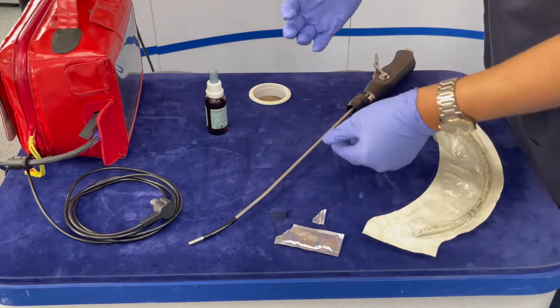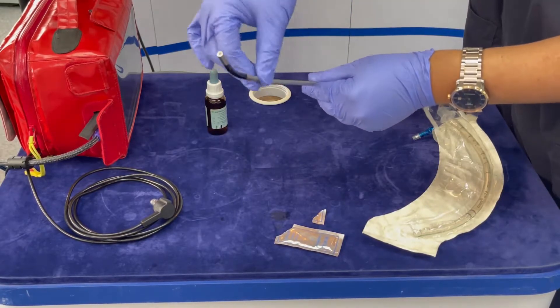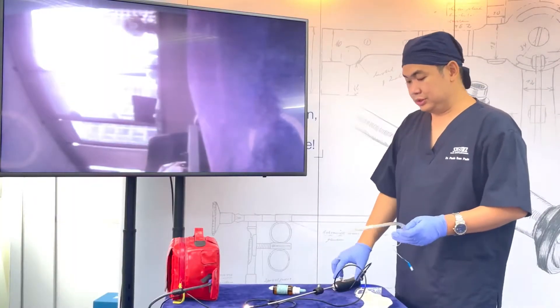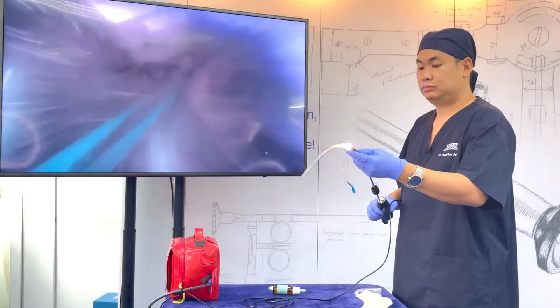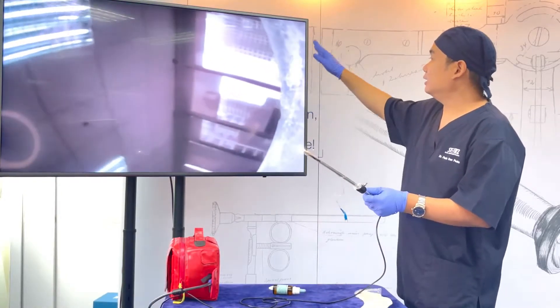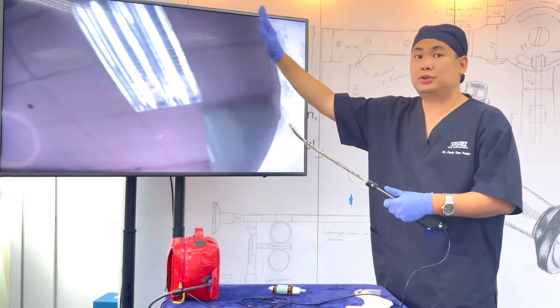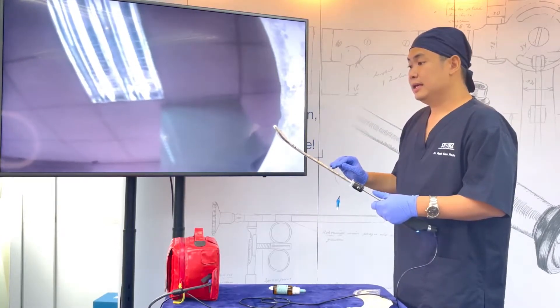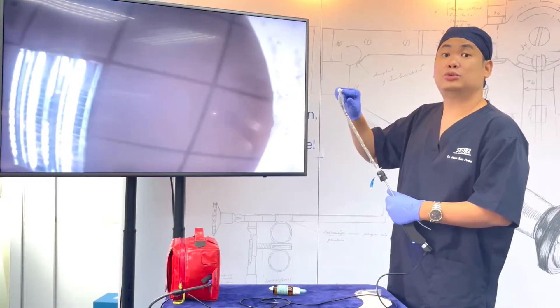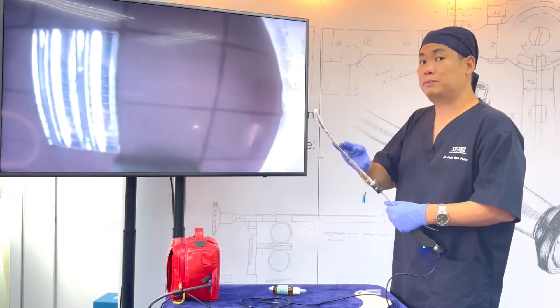Apply water-based lubricant on the scope, particularly on the articulating part. Place the ET tube on the scope. You should be able to see a small crescent at the side of the monitor — small enough so that it doesn't obscure the whole view, but big enough so that you'll know the scope is actually inside the ET tube. This will protect the patient from the scope and protect your scope from the patient.